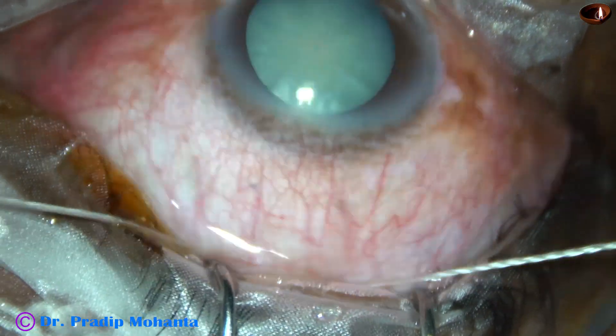There is going to be a high amount of astigmatism if we leave this wound unsutured. Cortical cleanup is done through the right side port. The cortex from 12 o'clock to 6 o'clock has been removed. Since there is vitreous upthrust, I cannot remove the cortex through the main wound. So I have to make another side port — at around 2:45 o'clock.